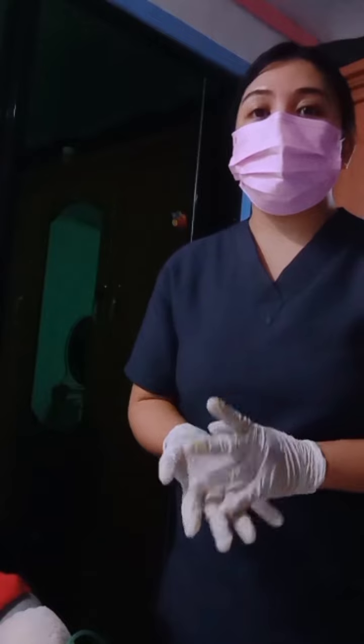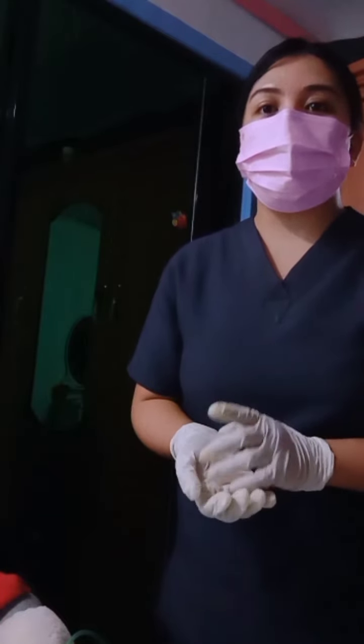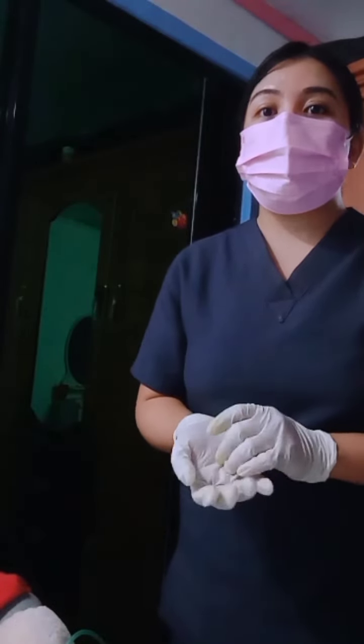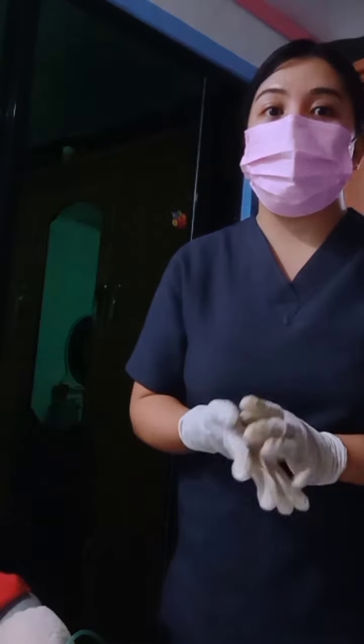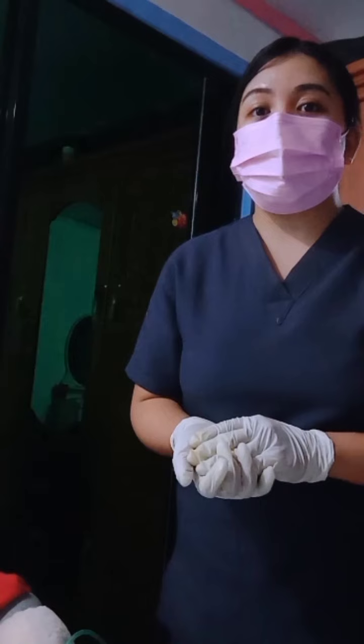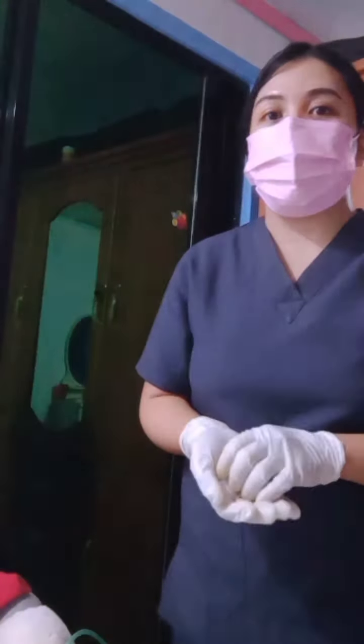When you're performing nasopharyngeal suctioning, a good general rule is to insert the catheter to roughly the same depth of the distance from the mouth or tip of the nose to the angle of the mandible. In adults, that's about 16 centimeters or 6.4 inches. In older children, 8 to 12 centimeters or 3 to 5 inches. And in infants and young children, about 4 to 7.5 centimeters or 1.6 inches to 3 inches.